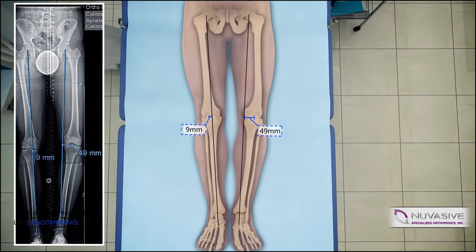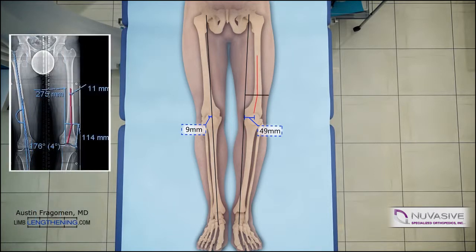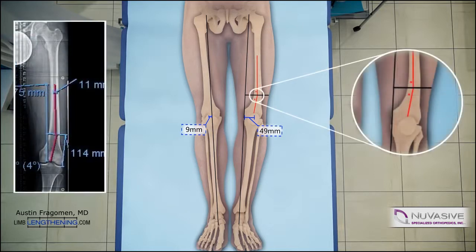This patient has a distal femoral varus and shortening deformity. The radiographs of the actual patient are on the left side. The red lines denote the proposed path of the IM nail, and the intersection of these lines is the osteotomy site. After deformity correction, the red lines will be collinear. The inset magnification on the right side shows blocking screw position. Blocking screws are very important for deformity correction and maintaining alignment during lengthening.